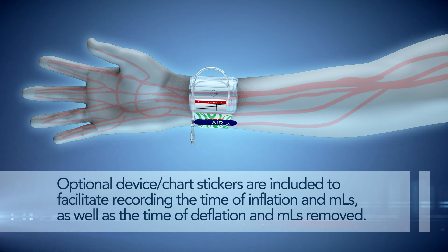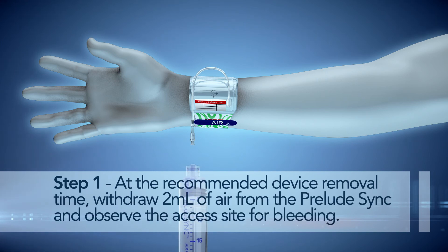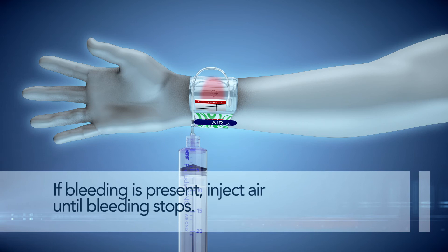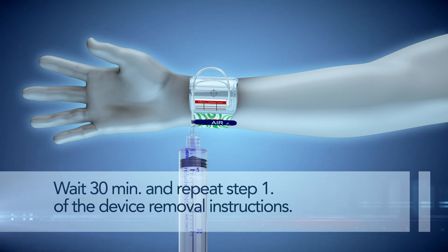Step 4. At the recommended device removal time, withdraw 2 mL of air from the Prelude Sync and observe the access site for bleeding. If bleeding is present, inject air until bleeding stops. Wait 30 minutes and repeat Step 1 of the device removal instructions.